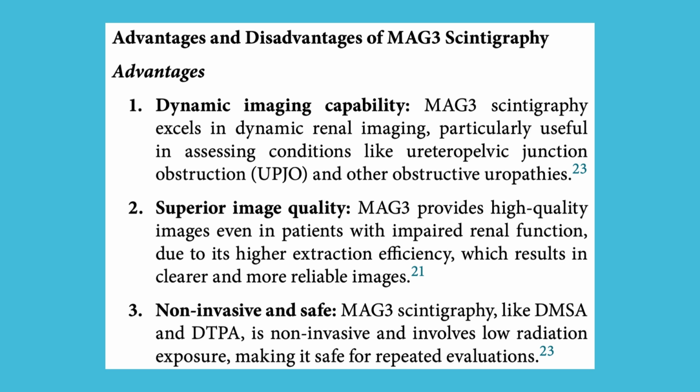Advantages. 1. Dynamic imaging capability. MAG3 scintigraphy excels in dynamic renal imaging, particularly useful in assessing conditions like ureteropelvic junction obstruction, UPJO, and other obstructive uropathies. 2. Superior image quality. MAG3 provides high-quality images even in patients with impaired renal function due to its higher extraction efficiency, which results in clearer and more reliable images.